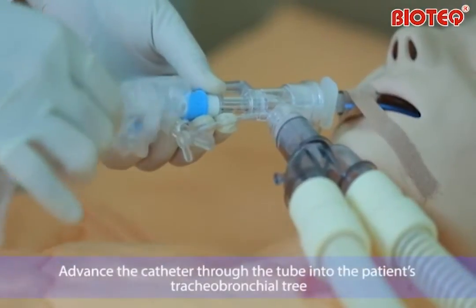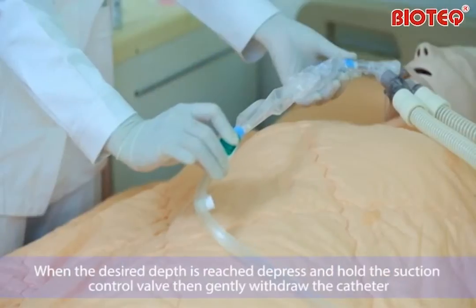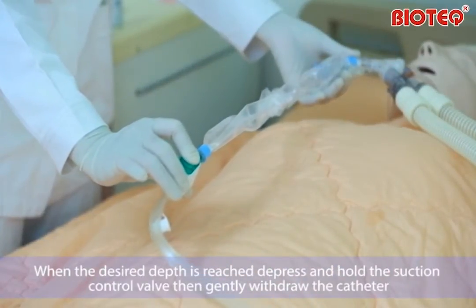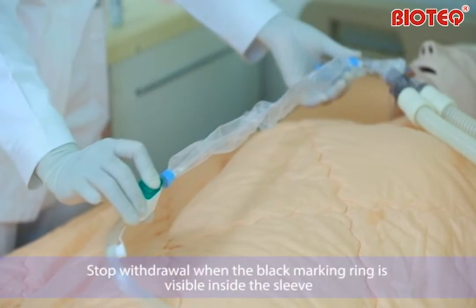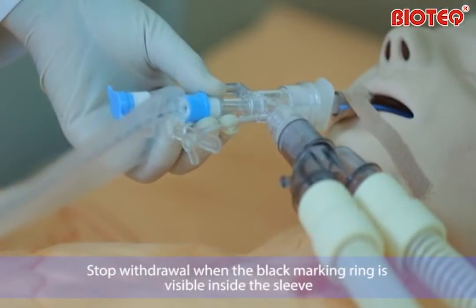Advance the catheter through the tube into the patient's tracheobronchial tree. When the desired depth is reached, depress and hold the suction control valve. Then gently withdraw the catheter. Stop withdrawal when the black marking ring is visible inside the sleeve.